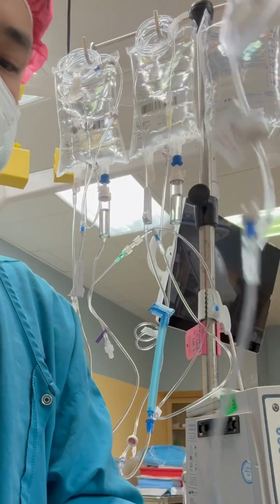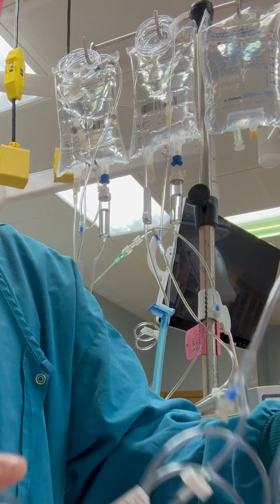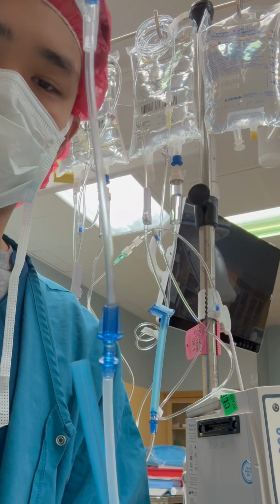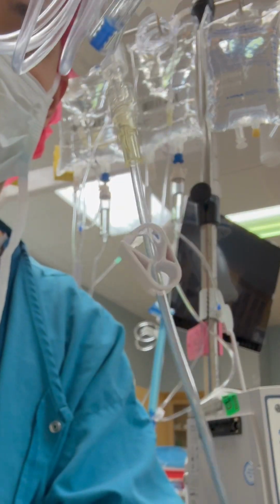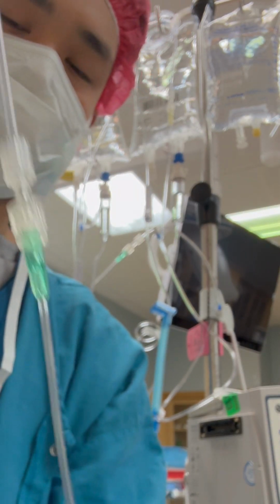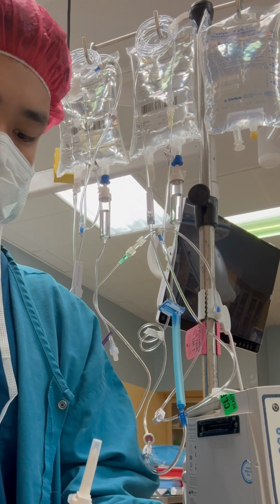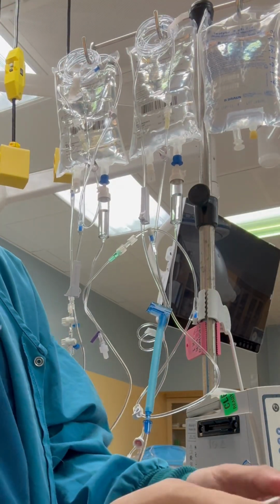Step one, have an Alaris tubing. Whether you use the Alaris pump or not, you're going to be running it through the tubing because that's just what we do. Next up, have an extension line to make it a bit longer. But lastly, you also want a J-loop because in surgery with kids, you'll be starting your own IVs. So that would be nice to have. Make sure your lines are clamped and then spike the bag.